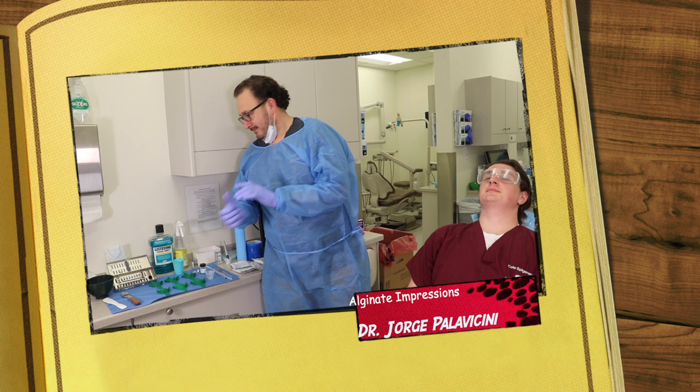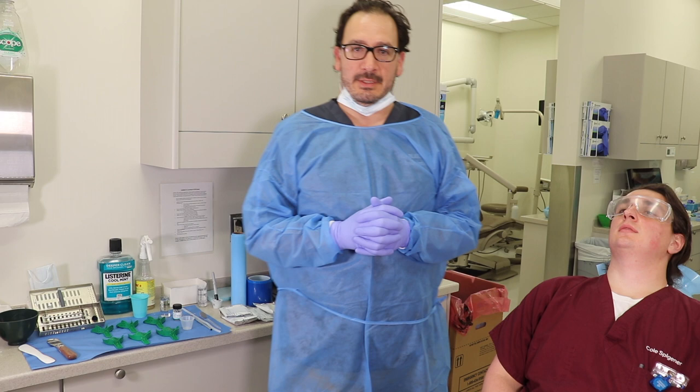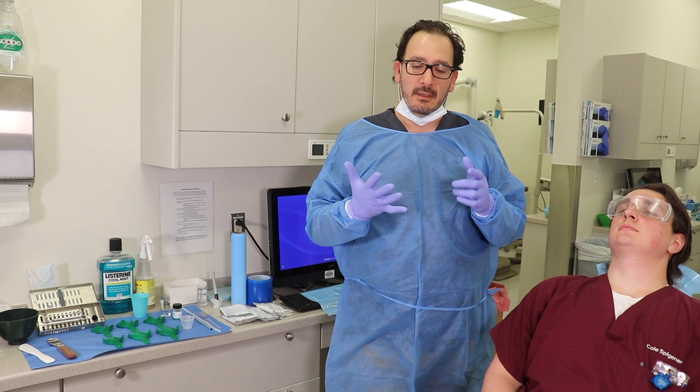This is our general impressions. And so we're going to go through the whole process of taking an alginate impression, okay? We use alginate impressions to take diagnostic casts.